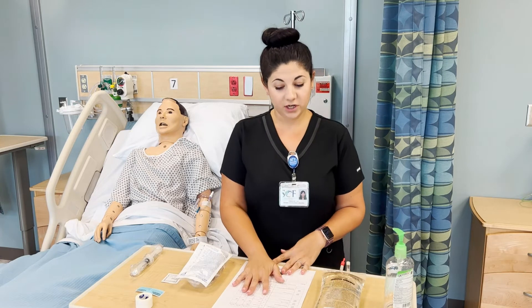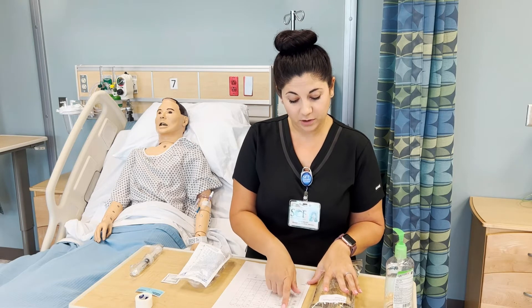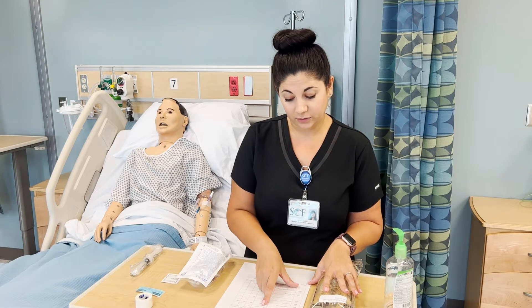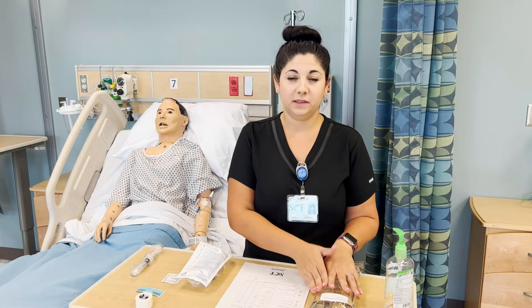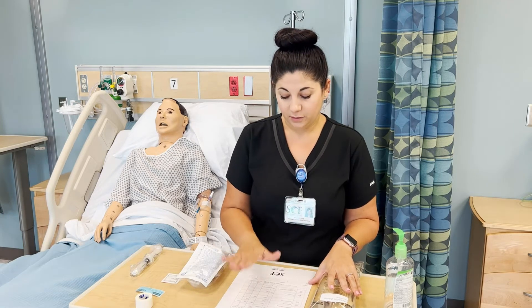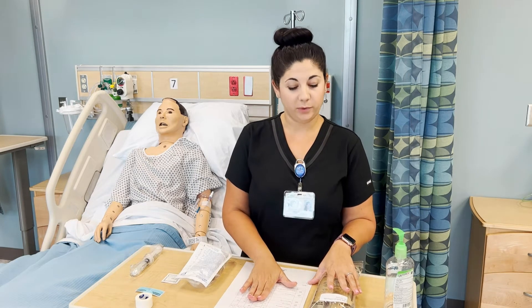Now we'll do our third check of the medication. I'm going to state the name of the medication on the MAR and state the name on the bag. We are going to double check the route is IV. These bags don't typically have a dose unless you have something like an additive of potassium chloride — if you do, then make sure you're checking that. Checking the time and that we have the correct frequency, which may be continuous for our primary IV.